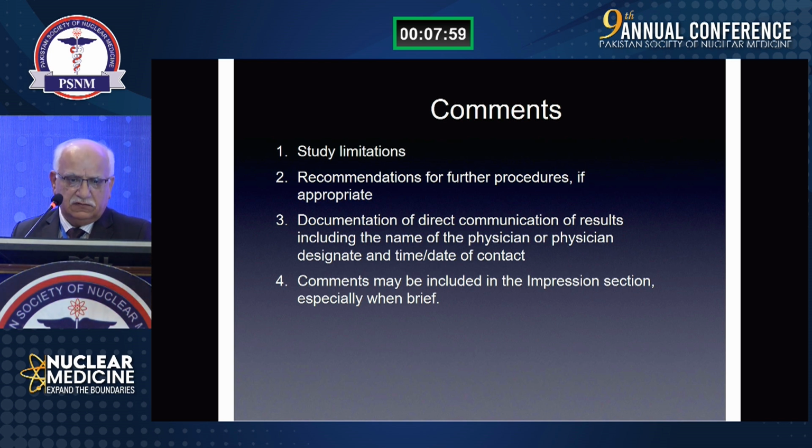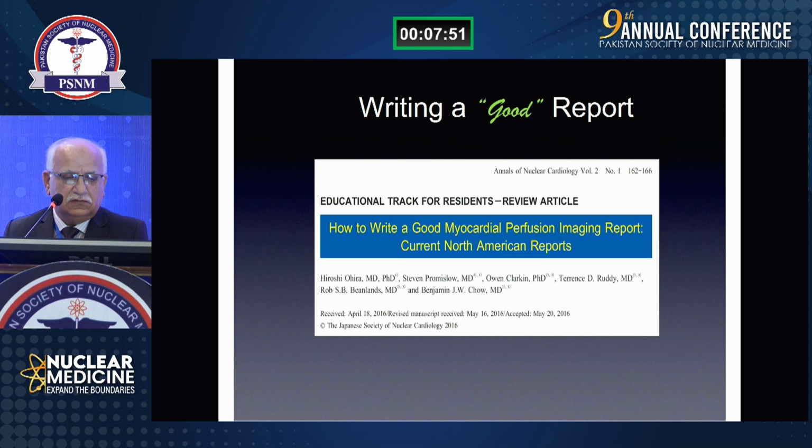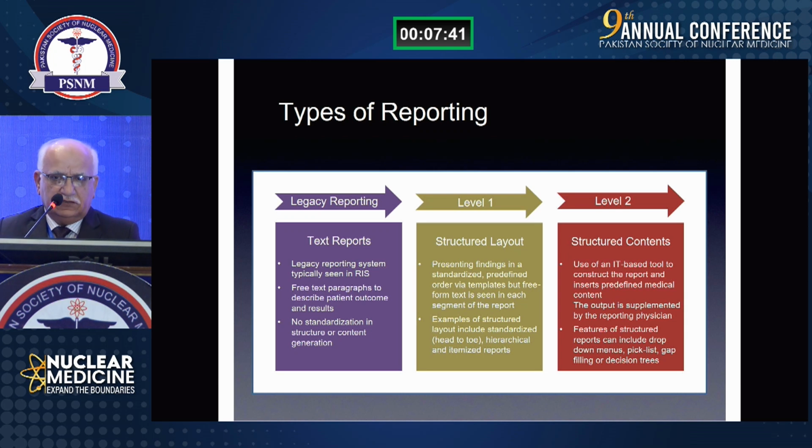So this was the first part, and writing a good report. There are several recommendations specific to most imaging modalities, for example how to write a good myocardial perfusion imaging report, and you can find this in the literature. But basically, how to write a report.